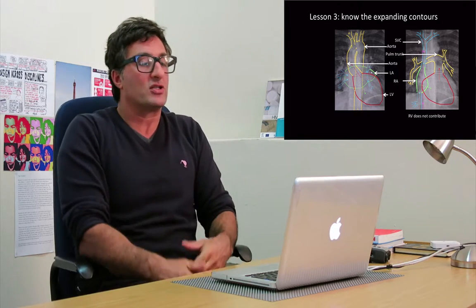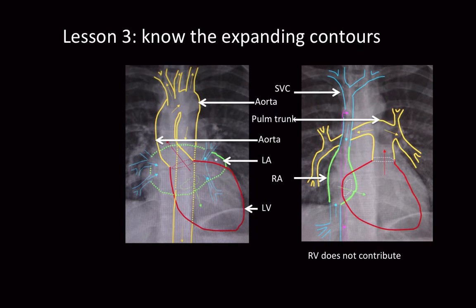The third lesson is to know your outline. It's quite difficult to teach without a picture, so I'll show you some anatomical structures that make up the outline. You can see that the aortic arch — whether the ascending or descending aorta — makes up part of the cardiac outline. The left atrium is a small segment of the cardiac outline, and the left ventricle as well.